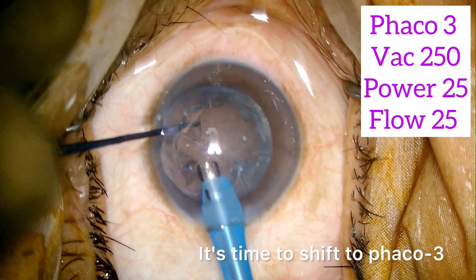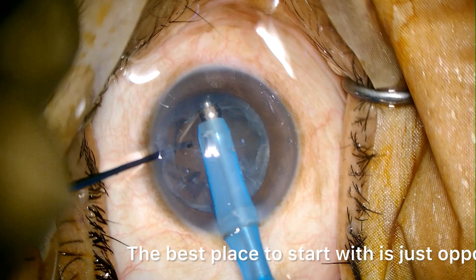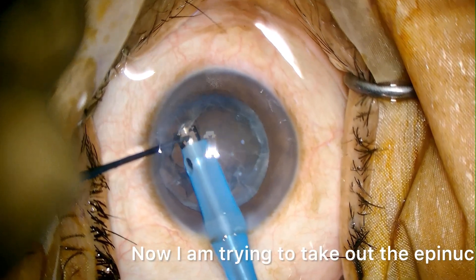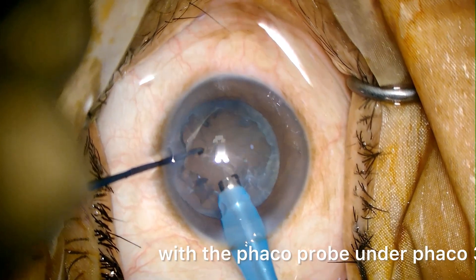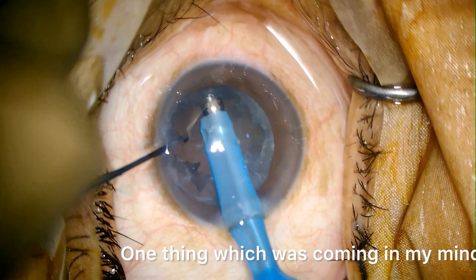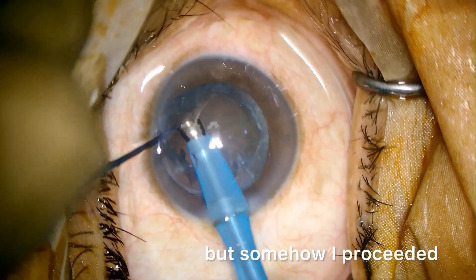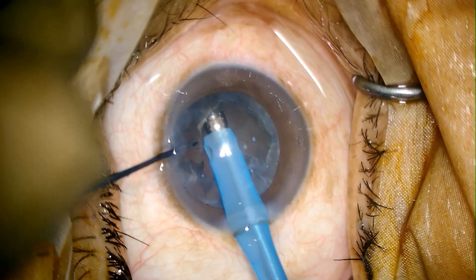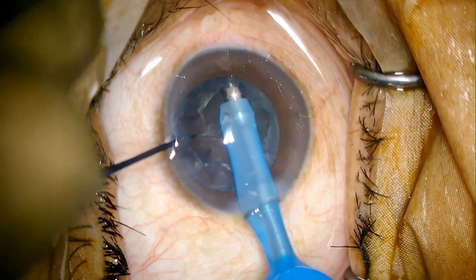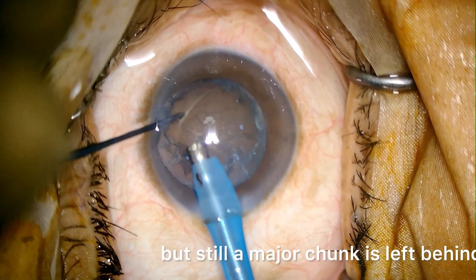It's time to shift to phaco 3, the epinuclear phase. The best place to start with is just opposite to your incision site. Now I am trying to take out the epinucleus with the phaco probe under phaco 3. It seems to be a little bit sticky. One thing which was coming in my mind was to remove the probe and to do hydro again, but somehow I proceeded. I am not able to hold the epinucleus, not able to get the catch. Some part I got, but still a major chunk is left behind.